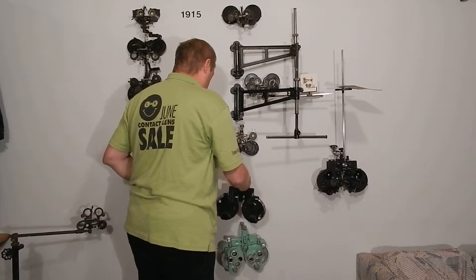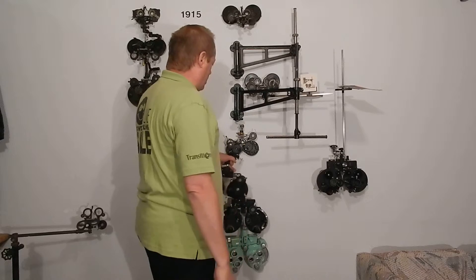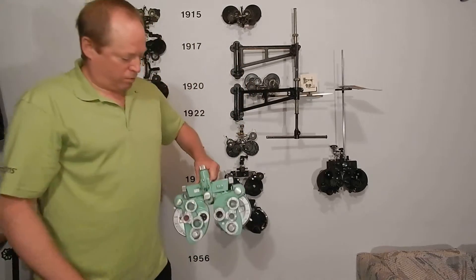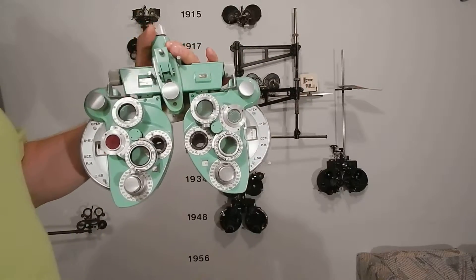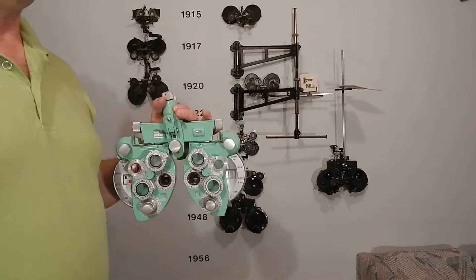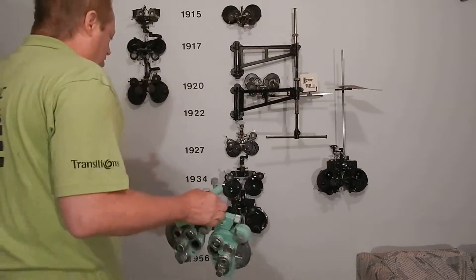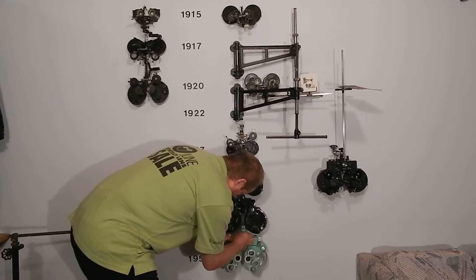Some of the old optometrists I've talked with say that the best refractor in those days was the Green's refractor. It wasn't until 1956 that AO came up with the real winner — and I'm not even going to describe that one because it's a modern phoropter. If you give eye exams, whether you're an ophthalmologist, optometrist, or optical technician, you're using these. Basically it hasn't changed since 1956, except that they yoked the cylinders in 1967.